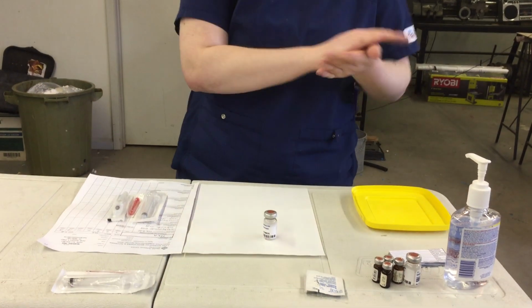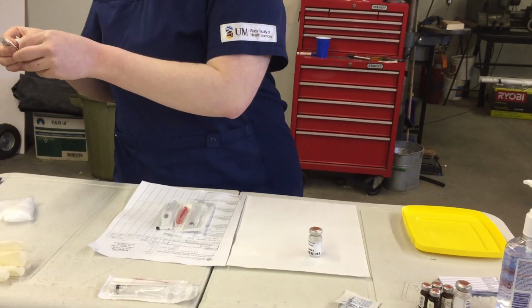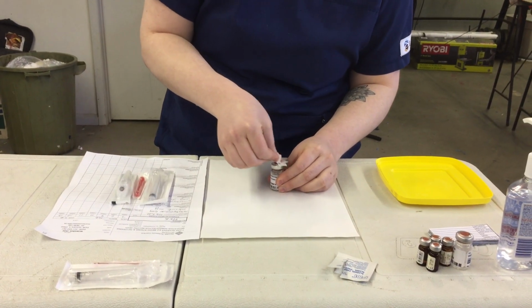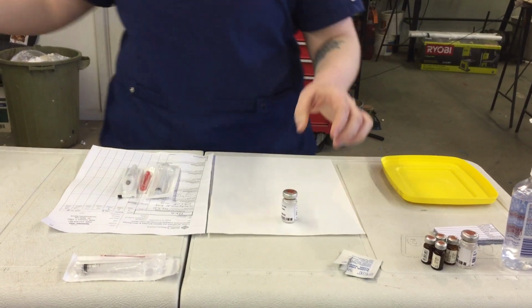Okay, so after I've done that, I'm going to wash my hands. I'm going to open an alcohol swab, and I'm going to throw that in the garbage, and I'm going to clean the top of my vial for 30 seconds in a circular motion. So we're going to say that was 30 seconds for demo purposes, and I'm going to let that dry. That can go in the garbage.